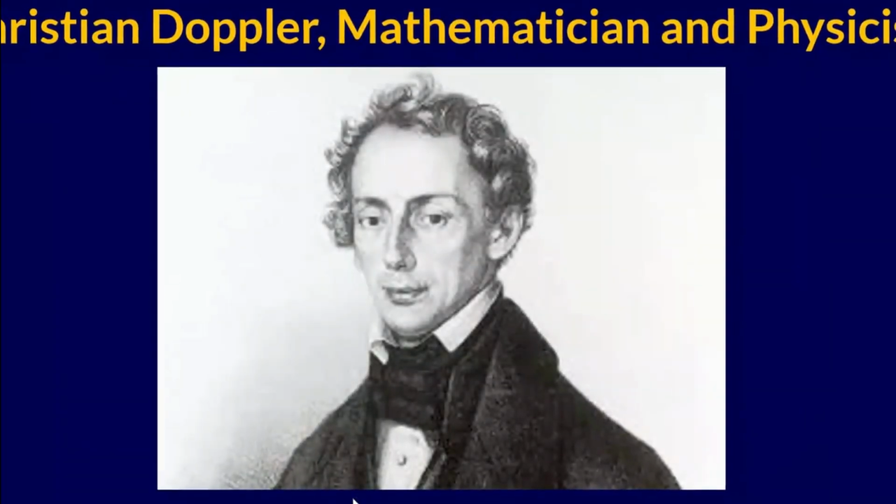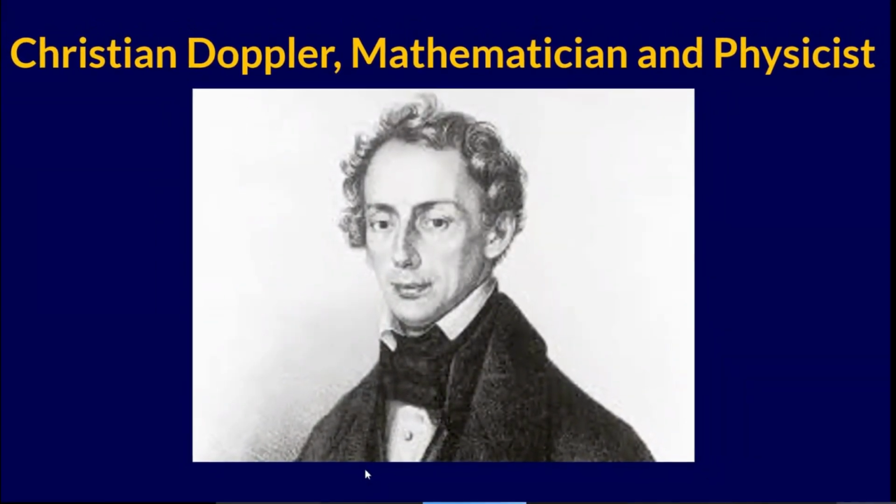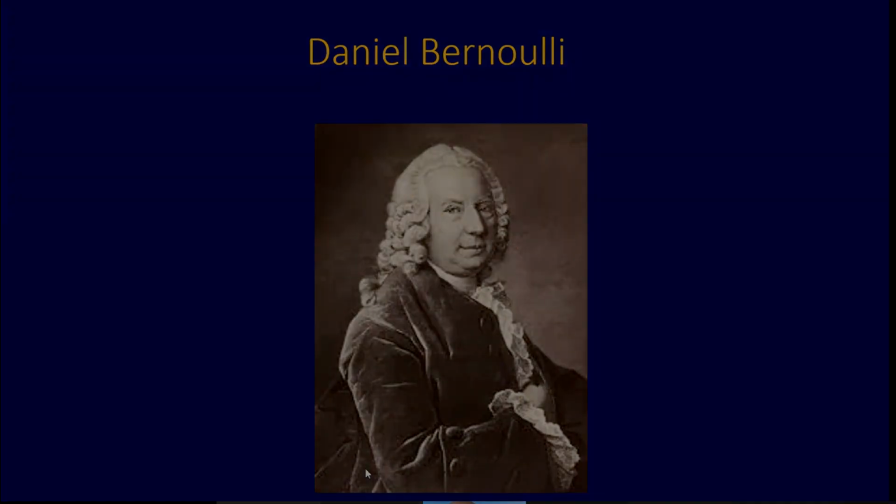When you talk about Doppler, we have to mention two names: Christian Doppler, who was an Austrian, born in 1803, who was actually working with astronomy, and he discovered the effect of change in frequency when the object is moving and there is a stationary transducer, and hence this effect is called the Doppler effect, which is used in Doppler echocardiography with advantage to the patient's benefit.